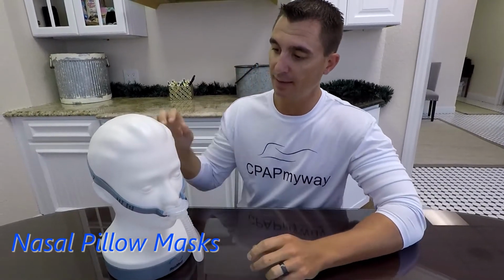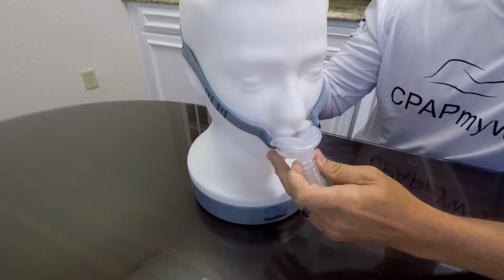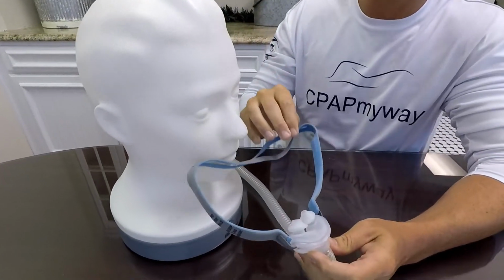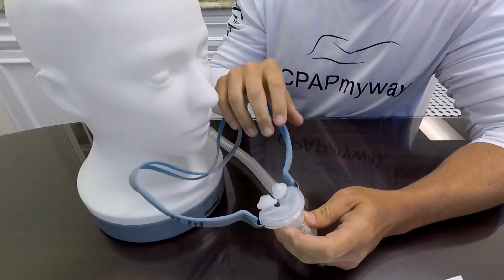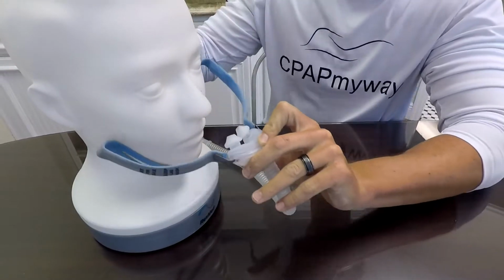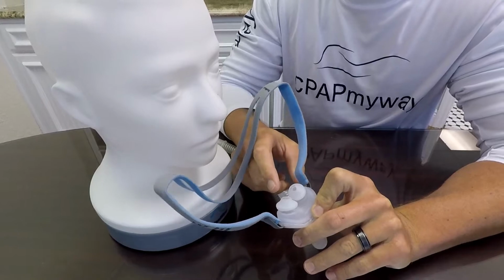So first up is the nasal pillow category. The mask we've got on the demo head here is the AirFit P10 nasal pillow mask. It's important to know that there are a bunch of different nasal pillow masks, so if you selected this one and didn't like it, there are a lot of other options. The one thing that defines a nasal pillow mask are these little nasal buds that rest on the nostrils. That is called a nasal pillow itself.